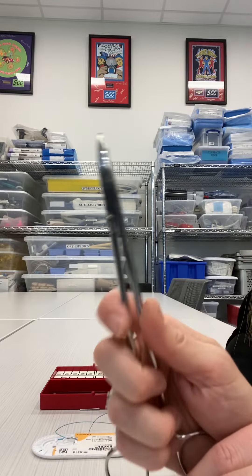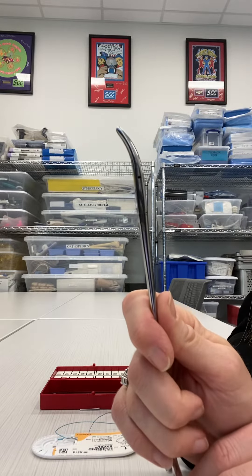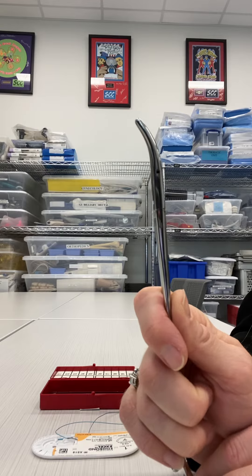The biggest key when loading a Haney needle holder is making sure the needle holder is positioned correctly before you attempt to load the needle.